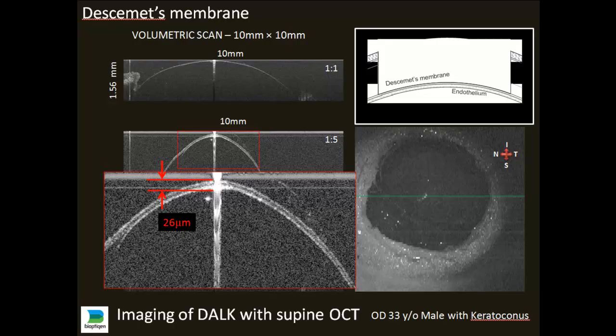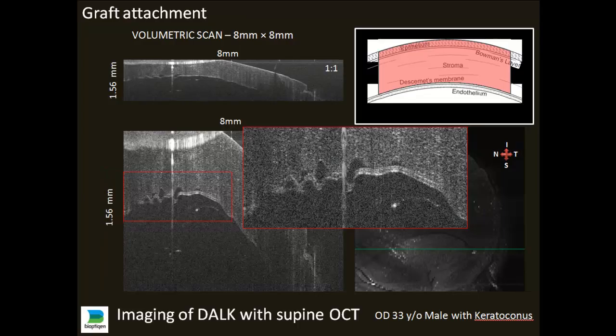Here is after the stroma of the donor tissue is sutured into place, and on top of our recipient Descemet's and endothelium. Here, if we have irregularity, we may want to fill the anterior chamber with air or saline to help get rid of these wrinkles on the posterior Descemet's membrane.